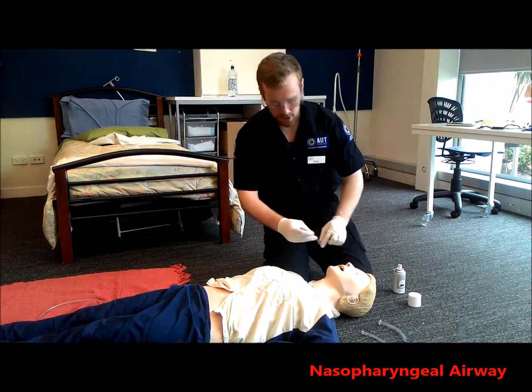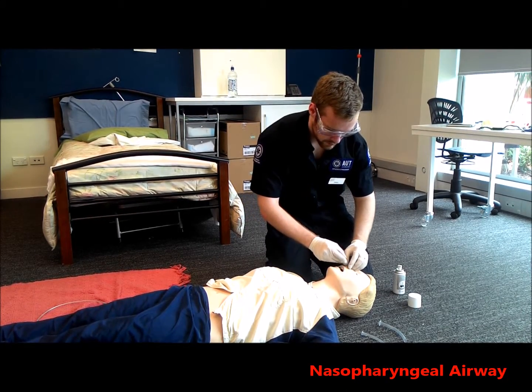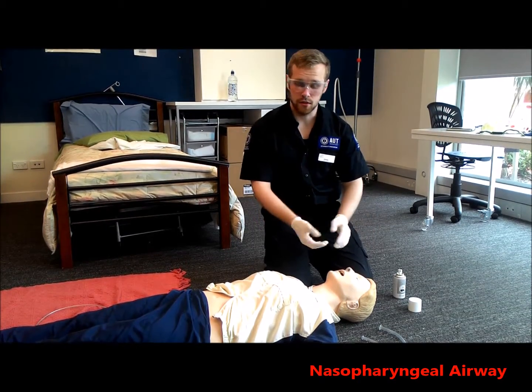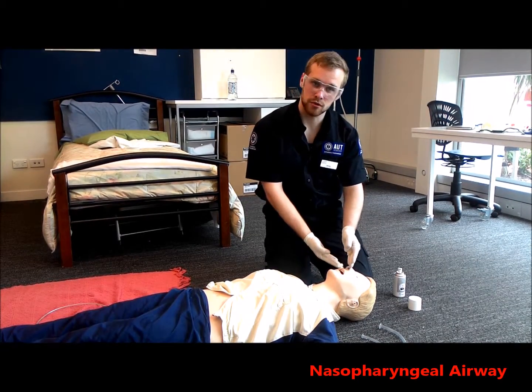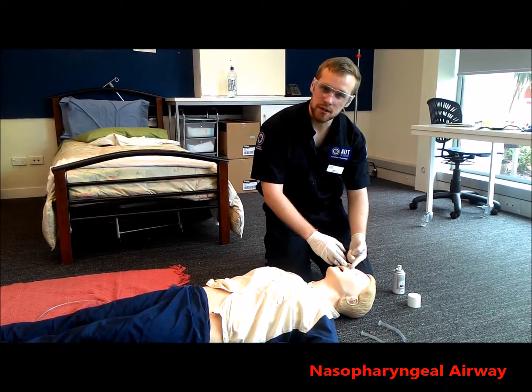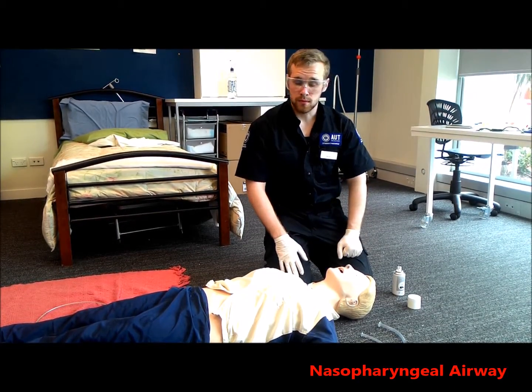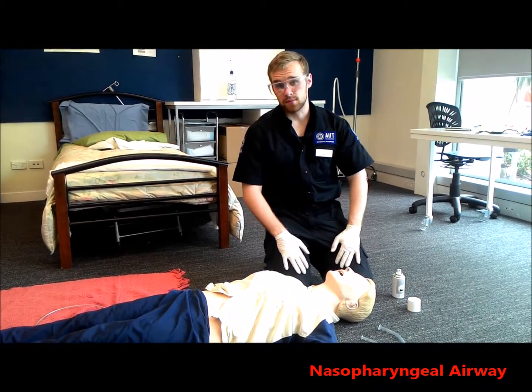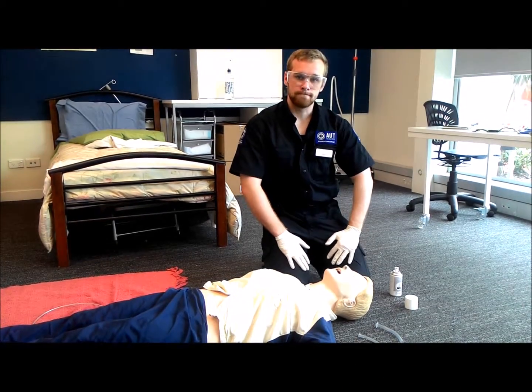You start off by positioning it 90 degrees away from the patient's face, and as you push it in, just slowly rotate. If there's resistance, you can rotate at 180 degrees, or if there's still further resistance, you can switch nostrils. You insert the NPA until the flange reaches the nostril. A contraindication to this would be if the patient has a suspected skull fracture, but the benefit is if the patients have a higher GCS, you can apply this instead of an OPA.